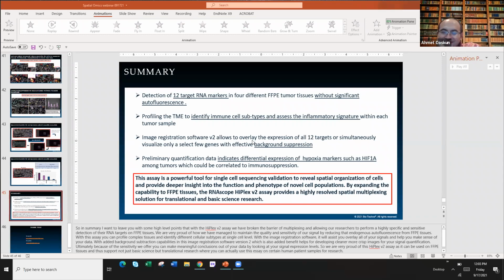But in this case, you have to know the target TCR sequence. Otherwise, each naive T cell has a different TCR, so it's probably unlikely you can look at all the different T cells. Yeah, you probably need barcoding, right? Because you need to know how many differences. You have to sequence basically. Correct, you have to do discovery. Yeah, image-based sequencing, exactly.